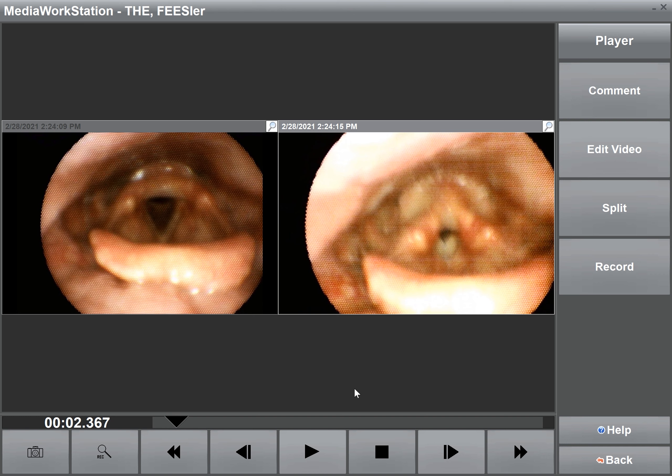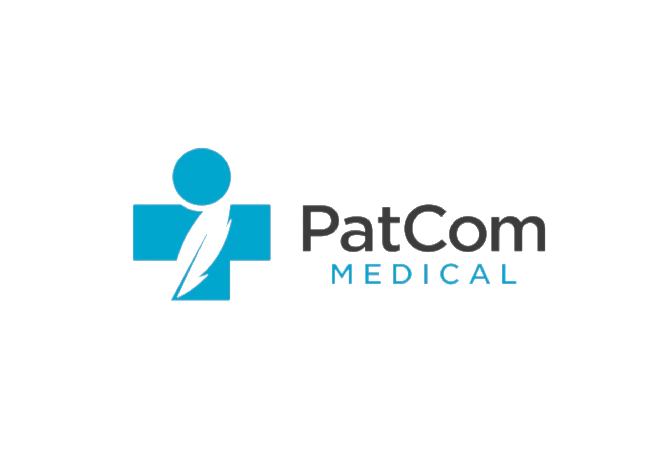Without auto exposure we were back after 100 milliseconds. To benefit from both the auto and non-auto exposure, Patcom Medical is working towards the ability to switch between exposure settings during your FEES exam. Thank you very much for listening and we will talk to you very soon.